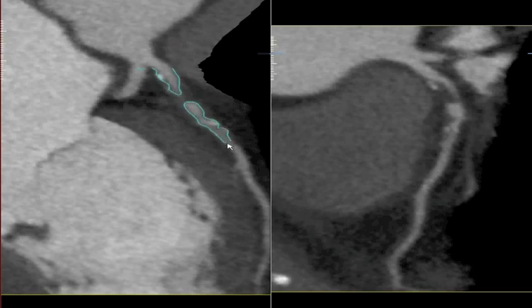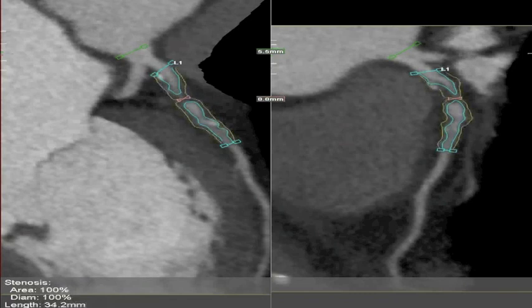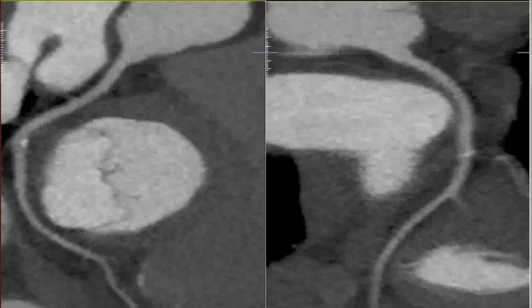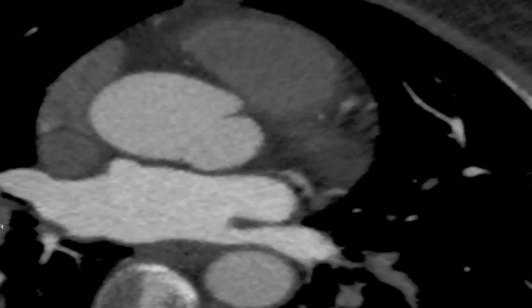The plaque measurement tool has some difficulty. As you can see, it clearly misses the calcium and includes the calcium within the vessel lumen. When you try to measure the calcium, it doesn't pick it up. It's even worse in the circumflex artery where the plaque measurement tool misses the calcium completely, and obviously any estimate based on this measurement will be incorrect.